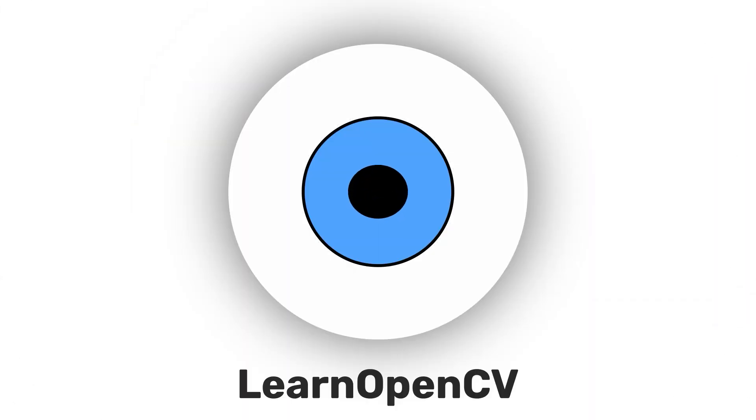Hey there, welcome to LearnOpenCV. In this video, we're going to explore instance segmentation for medical imaging by fine-tuning and comparing YOLO V8 and YOLO V9 models.